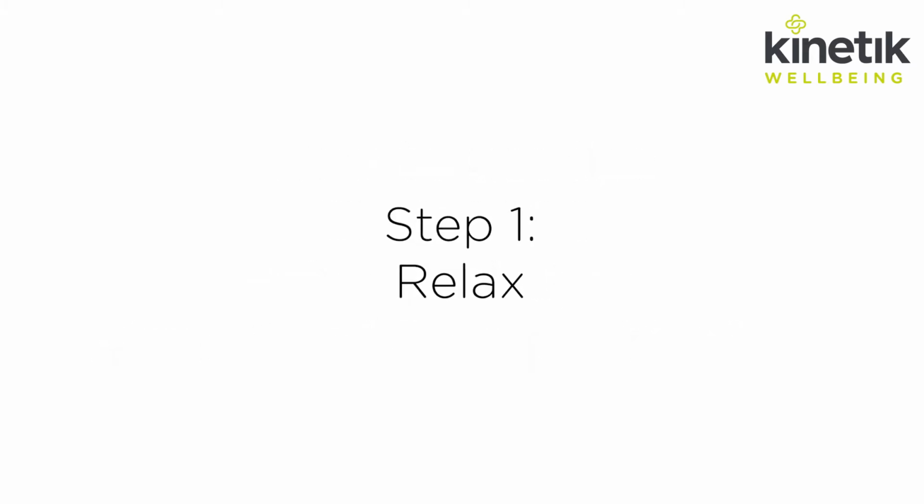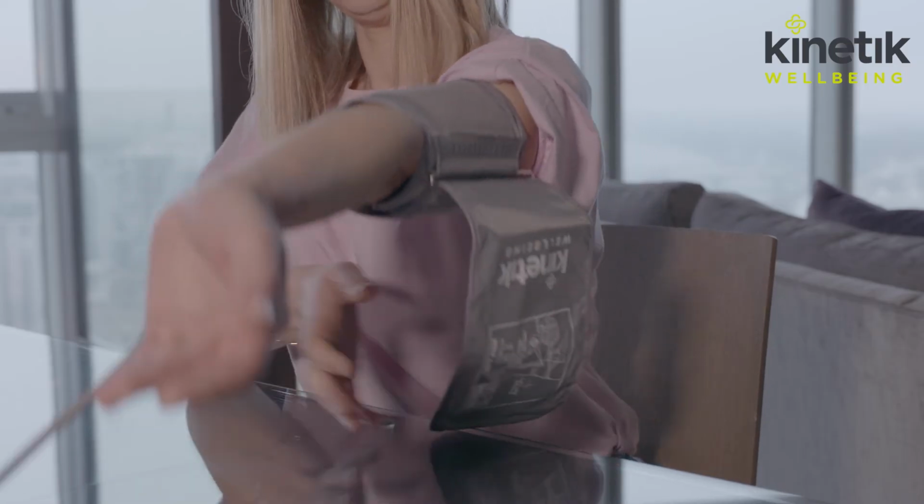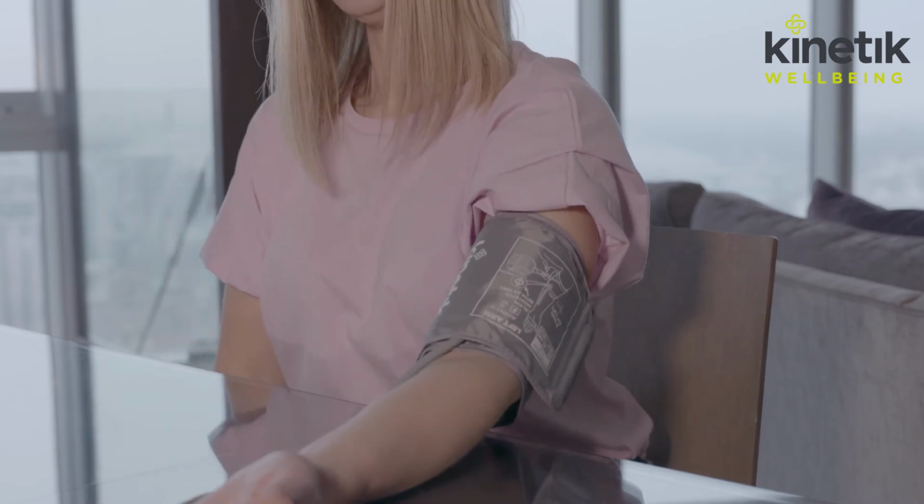Step 1. Relax. Rest for 5 minutes before taking your blood pressure. Don't eat or drink anything beforehand. Step 2. Apply the cuff. Use your left arm, making sure to remove any thick clothing and rest your arm on a hard surface.